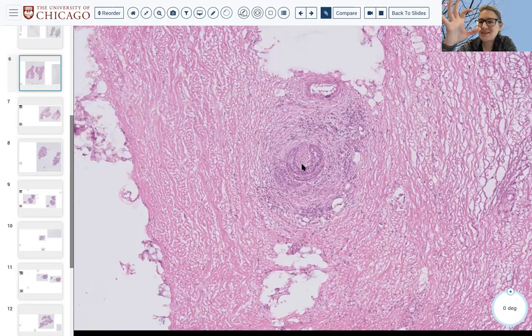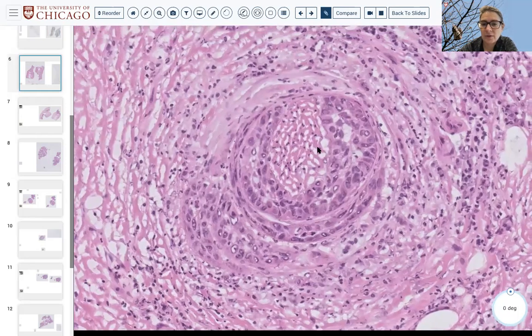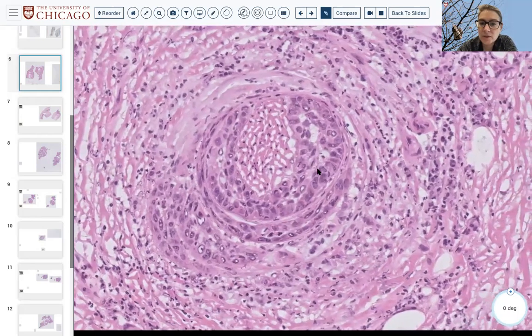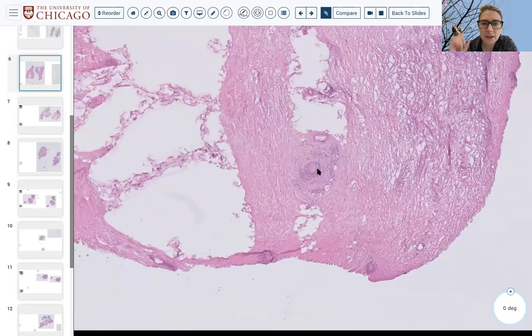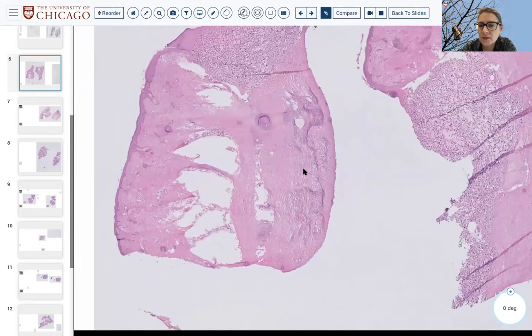So these C shapes or cup shapes that are surrounding some pale material, that is very often perineural invasion. So if you're ever uncertain whether something is tumor or not, but it has this kind of cuppy shape around what might be a pale nerve, be very, very suspicious, right? In fact, this is easier to see because the morphology is good, but yes, this is perineural invasion. But it's a good example of that kind of low power cue that might be what you're dealing with. Questions, comments?